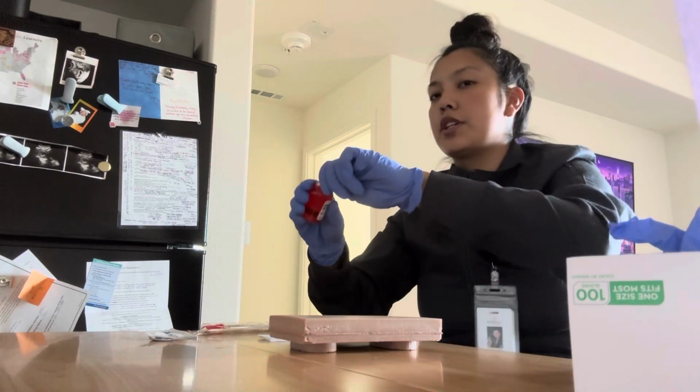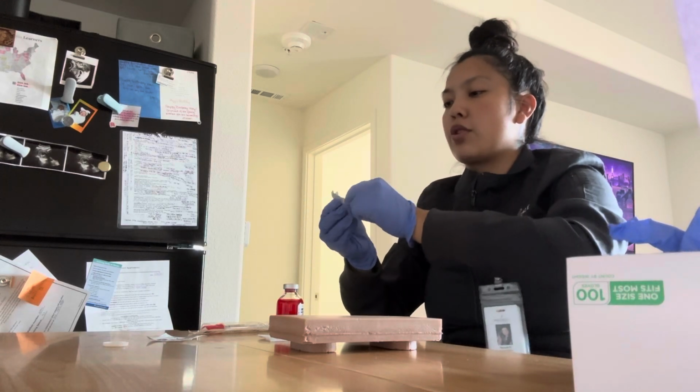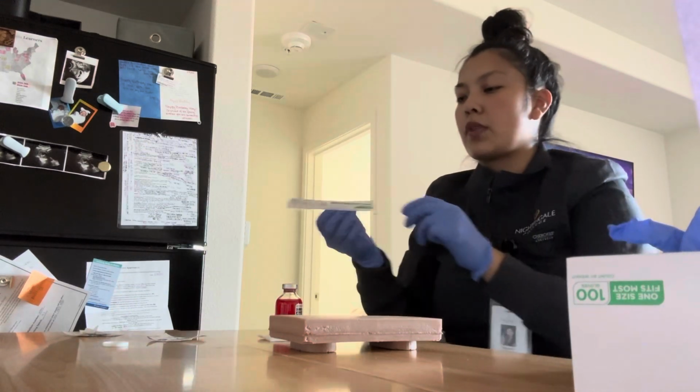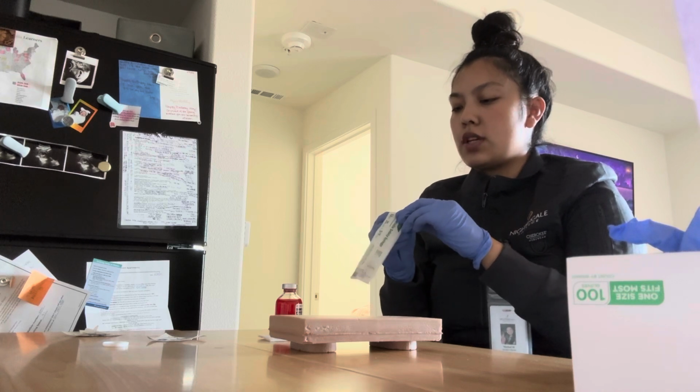It's my first time using it, so I'm gonna go ahead and take this cap off. I'm gonna open up an alcohol prep pad. I'm going to wipe it. Okay. I'm gonna go ahead and open up my syringe and needle.